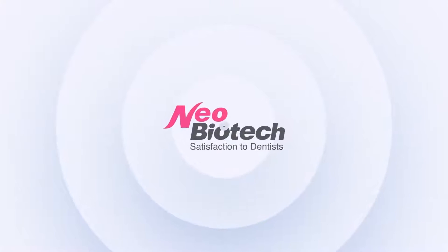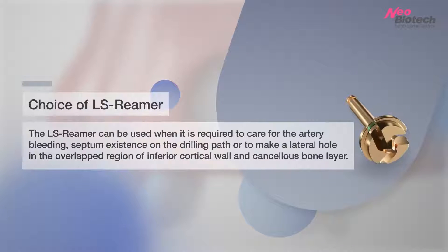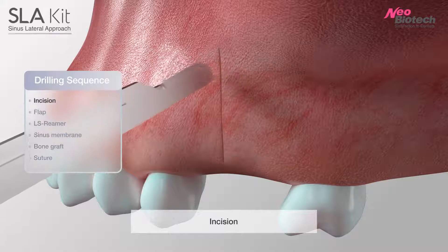SLA kit is the Sinus Lateral Approach kit, in use since 2008. The LS reamer can be used when it is required to address artery bleeding, septum existence on the drilling path, or to make a lateral hole in the overlapped region of the inferior cortical wall and cancellous bone layer.